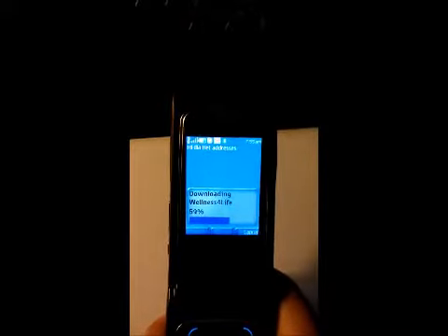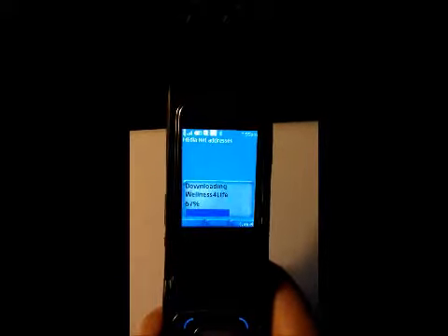It can also be used on smartphones too that have touch screens or anything like this. It can be used in Java phones, it could be used on Android phones, it could be used on an iPhone, it could be used on Windows phones, and it's probably supported by 300 or 400 or so different types of phones on several networks and in Europe.